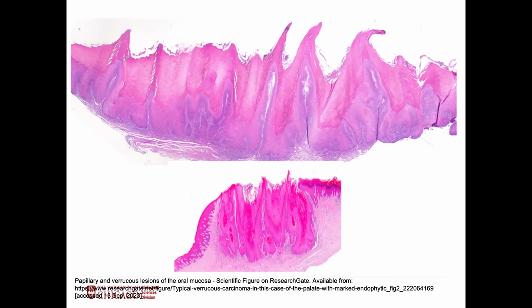Differential diagnosis includes verruca vulgaris or well-differentiated squamous cell carcinoma. Adjacent mucosa or underlying mucosa is not present for evaluation or cannot be assessed for pushing invasion due to fragmentation and lack of orientation. And the clinician kind of has to make the correlation.